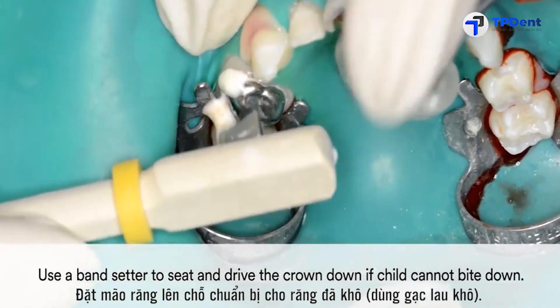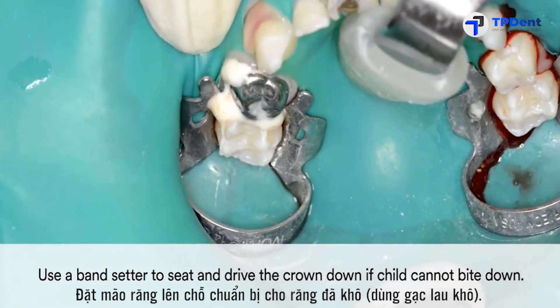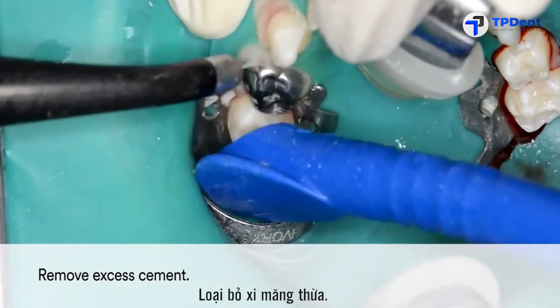If the child cannot bite down, use a band setter to seat and drive the crown down. Finally, remove excess cement and the restoration is completed.